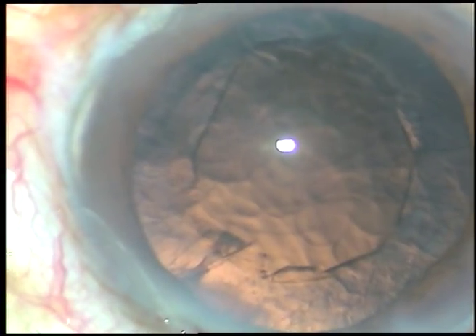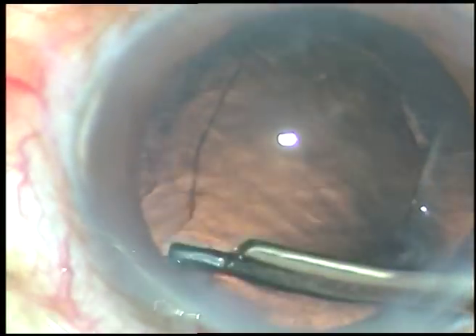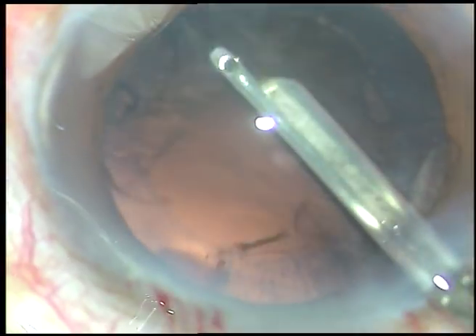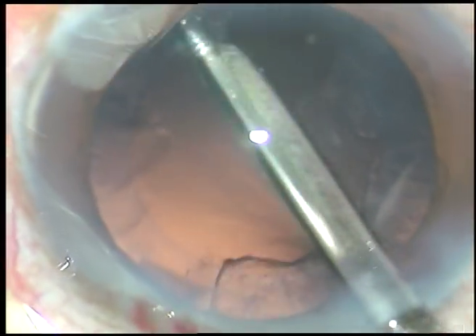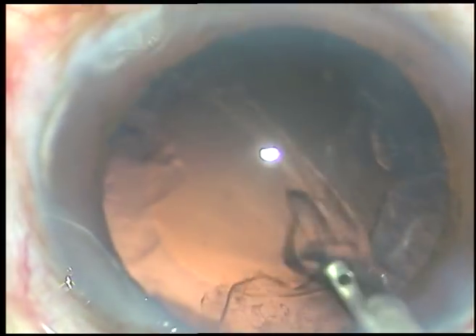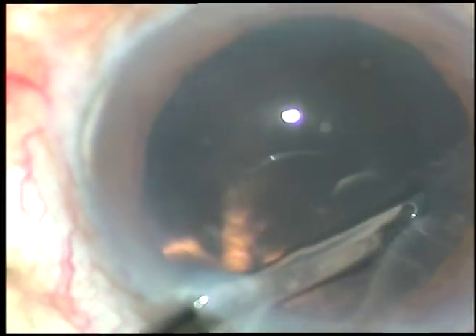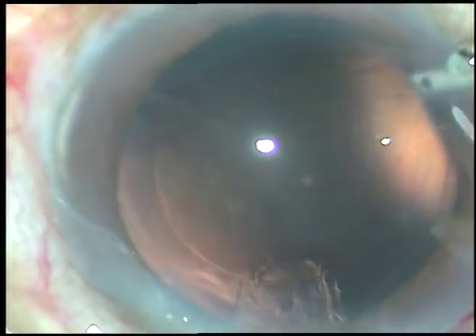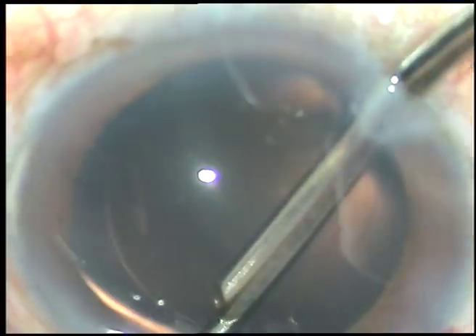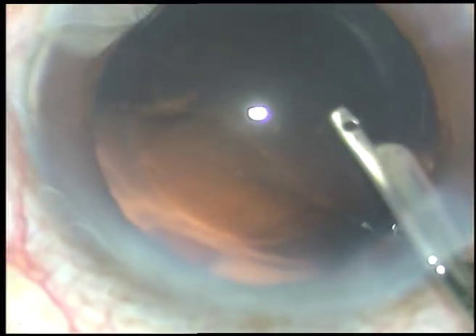The nucleus and epinucleus have been removed. Now the cortical matter is being removed. It is very easy to remove this cortical matter with a 23-gauge Simcoe cannula — it is very fast, very simple, and the anterior chamber maintenance is much more controlled than bi-manual. It saves a lot of time. The cortical cleanup is done.